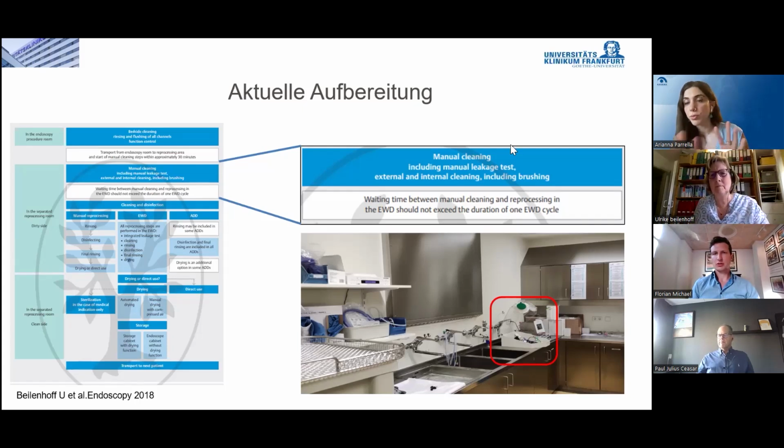Yeah, yes, it's mandatory to protect. I don't know Florian's experience, but I think that is quite fundamental to protect the operator. Yeah, I think what is quite interesting is that you can either use the box of the Aqua Typhoon as you presented it, or you could also use a sink and put a glass over it, which is also possible, and I think might even be a little bit better idea if you have already installed all the sinks.